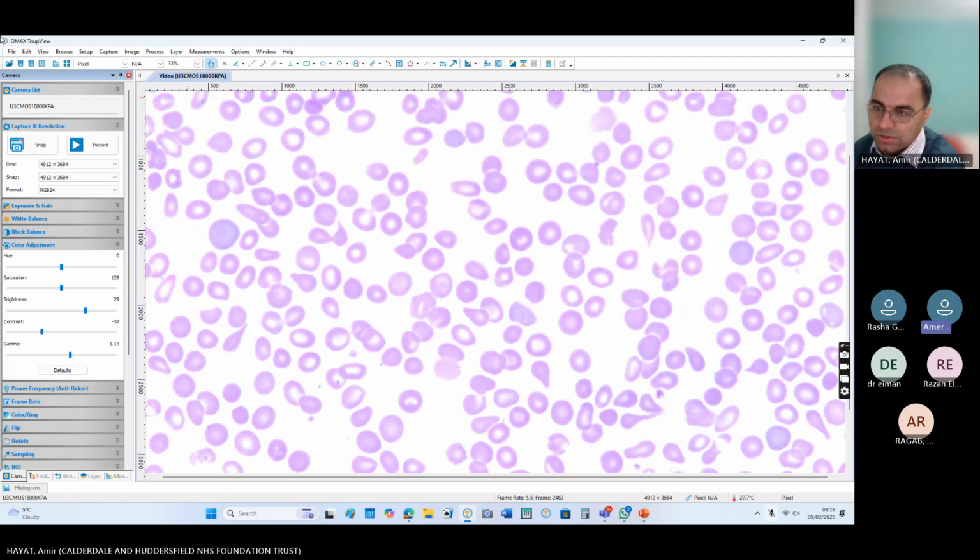So this patient has Howell-Jolly bodies. What does it signify? Hyposplenism. Hyper or hypo? Hyposplenism, sorry. The patient is 56 years old. He has developed hyposplenism and he has anemia as well. So what will be your differentials in your mind if someone has hyposplenism and anemia at the age of 50?